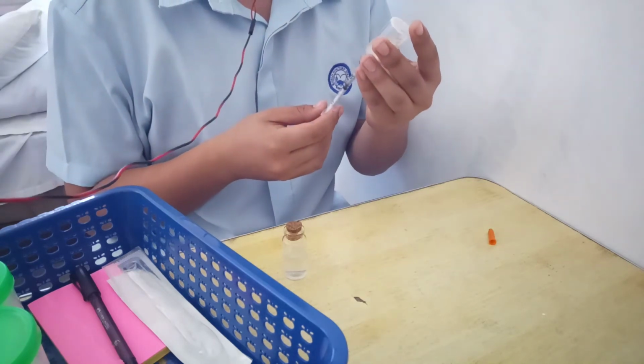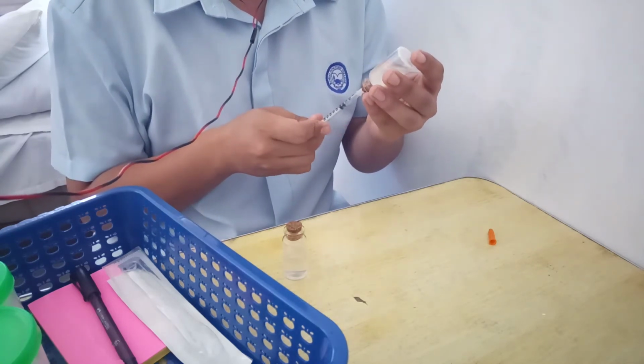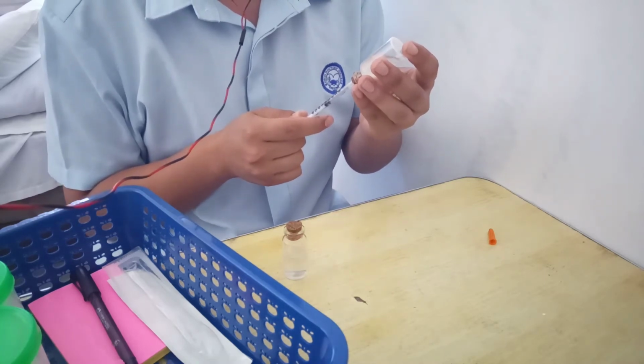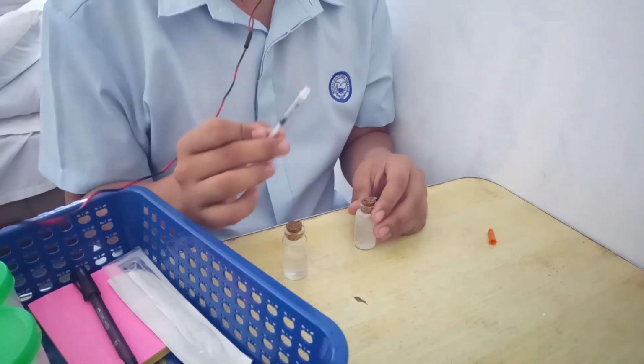Upside down, eye level, and vertically. 10 units. Turn the vial over and then remove the syringe. So carefully recap the needle.